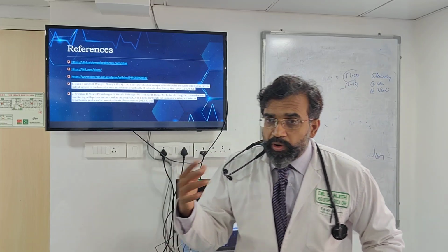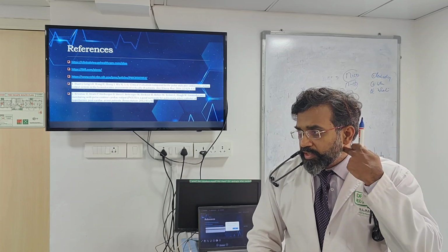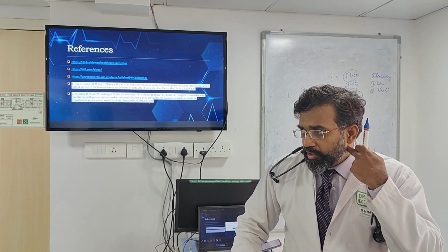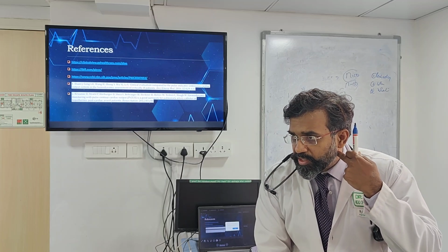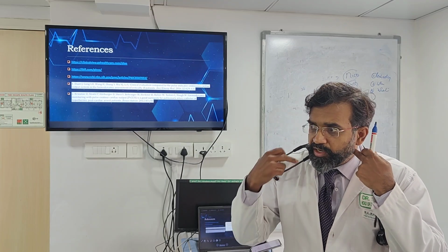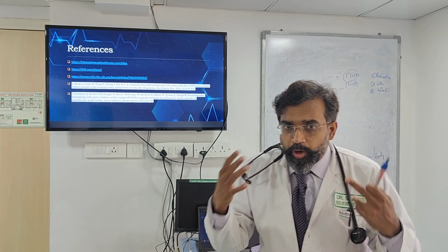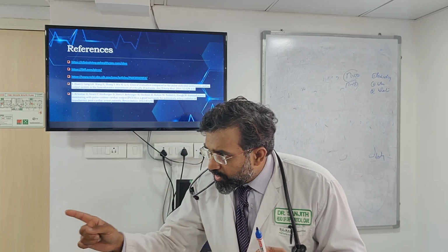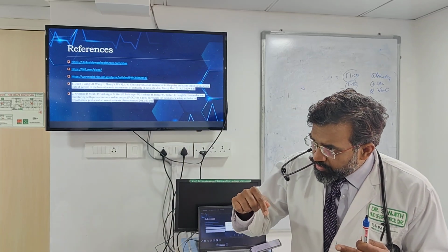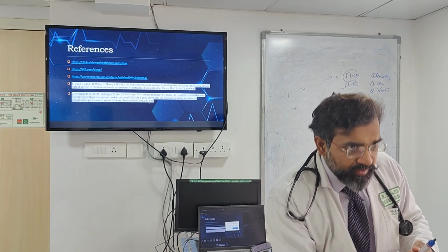A good question. Say, for example, you put it the other way around. You put a dialysis line and a central line here and an arterial line here, or you put a central line here and the dialysis line here. Something like that, then there will be problems. Between the indicator injection and the thermistor, there should not be another device.